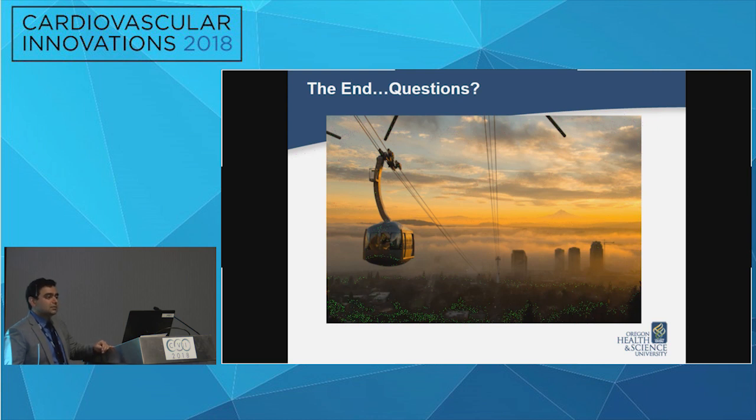We have to congratulate it works, but you embolized, and the high implant. So in retrospect, I know that Medtronic is going to do a bicuspid trial, but now that you go into practice at some point, would you say, hey, surgeon, you have to take this patient on, or would you try this again?